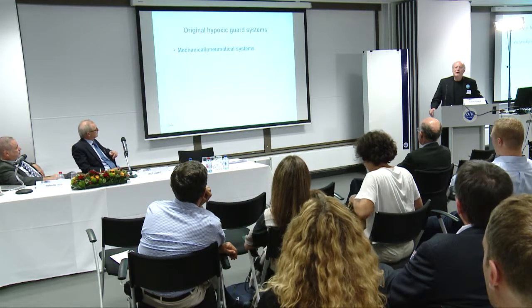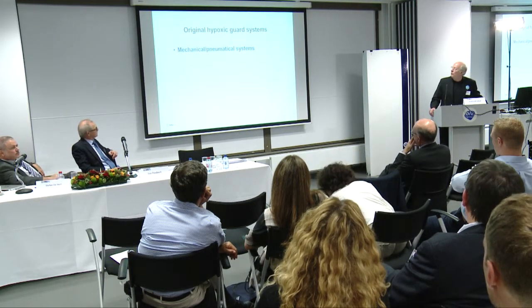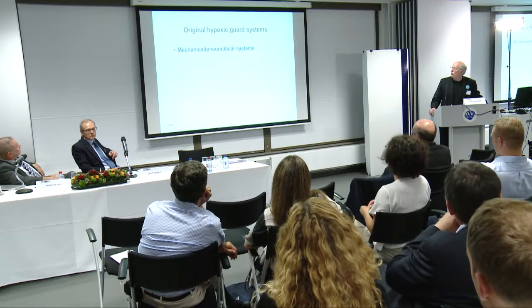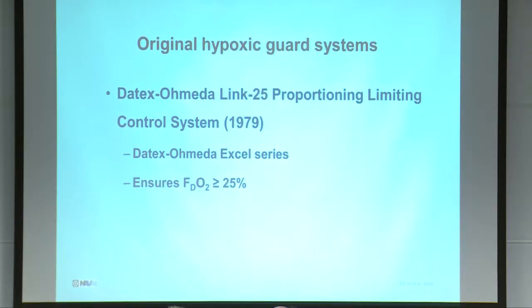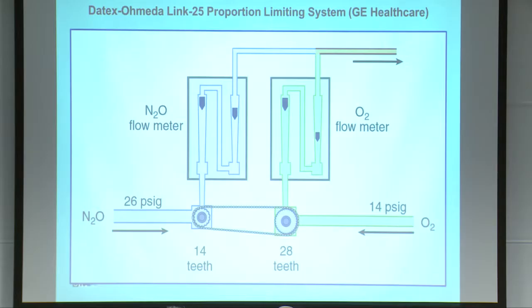So the original hypoxic guard systems that were developed by the companies were really mechanical pneumatical systems. So the first one that I'm going to describe is the Datex Ohmeda Link 25 system. Was patented in 1979. I don't know exactly when it became clinically available in their anesthesia machine. There is, as I said before, very little literature on all this stuff. It's used in the Datex Ohmeda XL series, and it was very simple. It ensured a delivered oxygen concentration of more than 25%. It said nothing about inspired concentration.